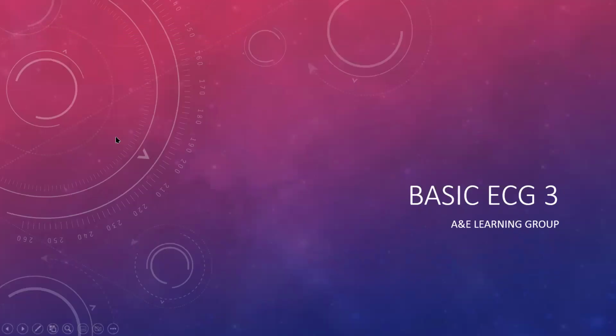let's get going so that we can try and learn something. Whoever was with us last week on Monday will probably look at today and think, okay, we're looking at the same thing, but we're actually looking at something completely different. So we're going to try and simplify what we're looking at, and hopefully you guys will get a bit of an idea of how to look at this.